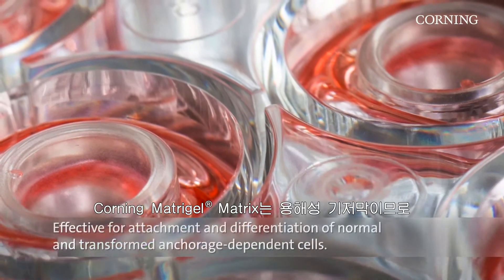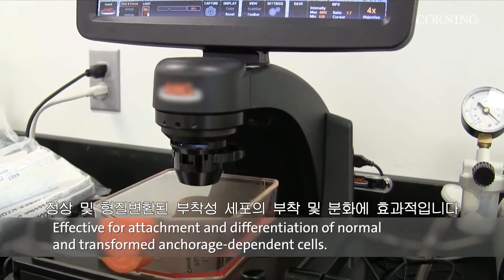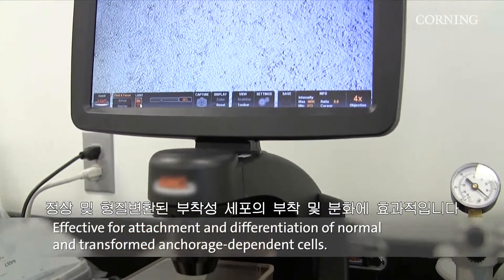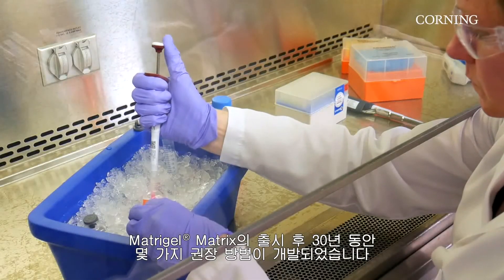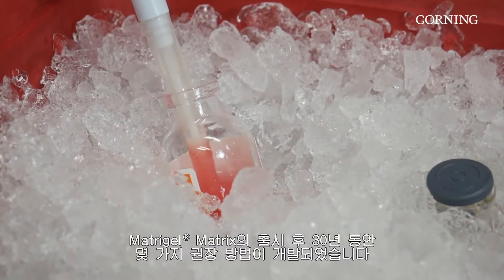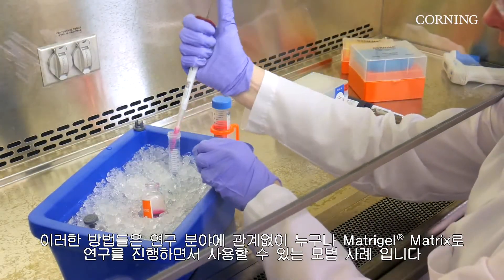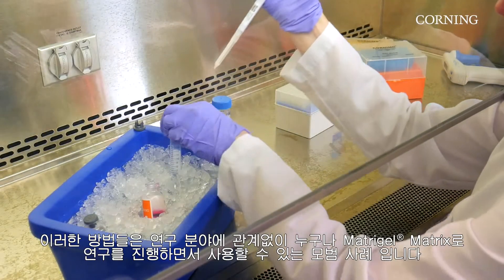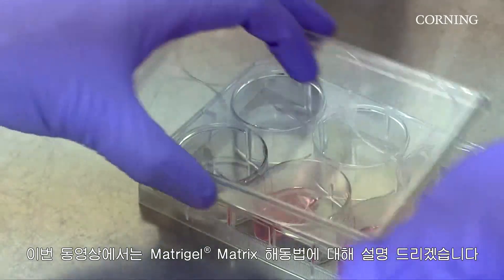Because Corning Matrigel Matrix is a solubilized basement membrane, it is effective for the attachment and differentiation of both normal and transformed anchorage-dependent cell types. In the 30 years since the launch of Matrigel Matrix, some recommended methods have developed. These are best practices that anyone can use while working with Matrigel Matrix regardless of application. This video covers how to thaw Matrigel Matrix.